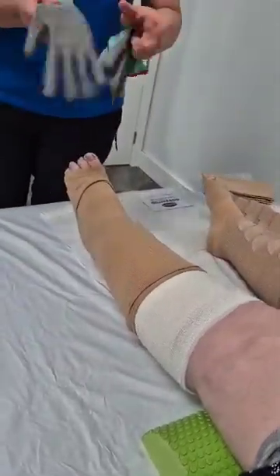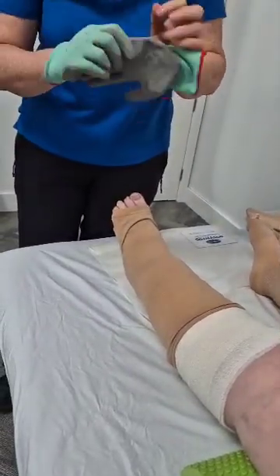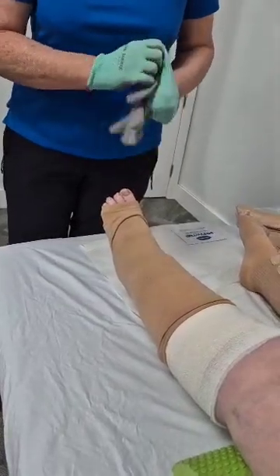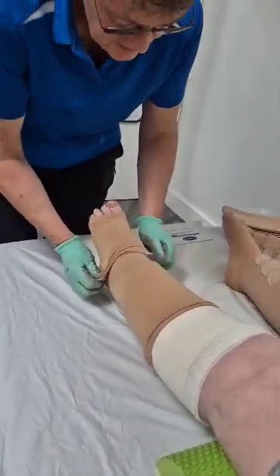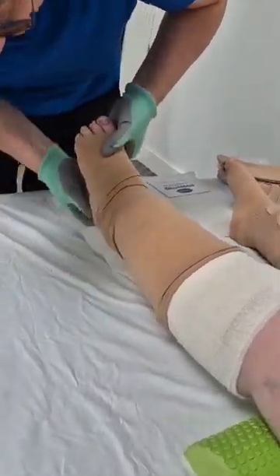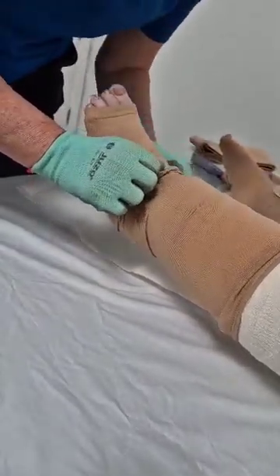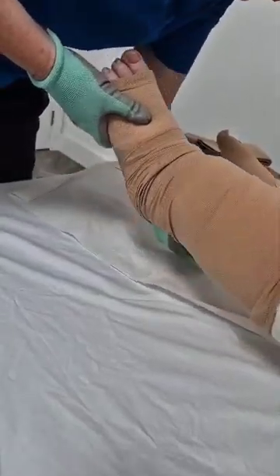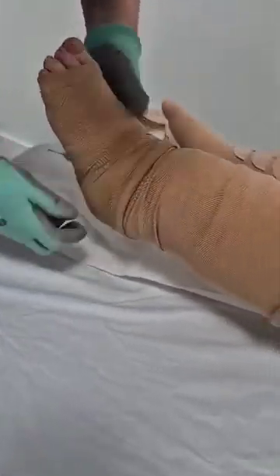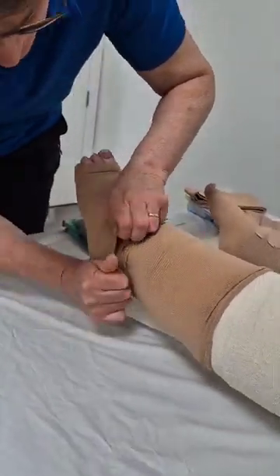And then I use a pair of gloves that are like gardening gloves. So if you can get something that has a bit of grip on them, they are really good. You might want to get yourself a pair, and maybe your carers can use them, because you can just get a nice grip on the garment, or the liner as we're talking here. You just want to get that heel in place. Nice, and we're trying to not disturb the crepe bandages underneath, so you sort of need to pinch them away.